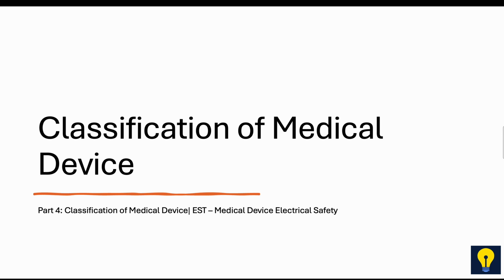Hello again, everyone. We're going to go to the last part of our series in medical device electrical safety, and today we're going to dive deep into the classification of medical devices. There are two forms of classification with medical devices. The first one is the actual classes, which is categorized as class 1, 2, and 3.